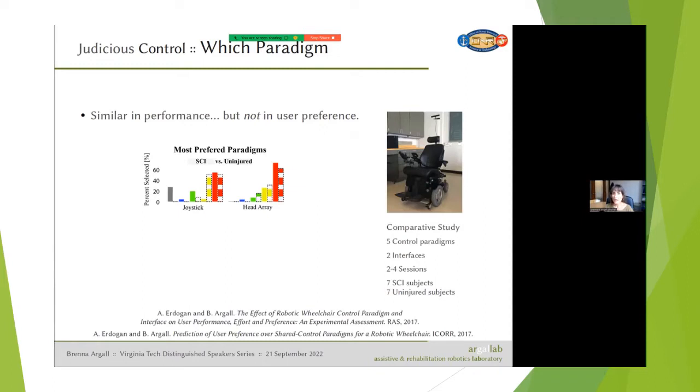And what we saw was that every single paradigm was selected at least once as most preferred, and every single paradigm was selected at least once as least preferred. I should say that we allowed for ties, so we didn't restrict people to having one that they preferred the most or preferred the least. And we certainly can see some trends, like some are certainly preferred more than others, but it was not uniform across the board that we could have eliminated any of these because it was what nobody wanted. And so all this is really telling us is that we should be presenting people with options.